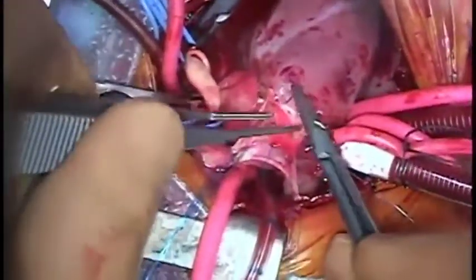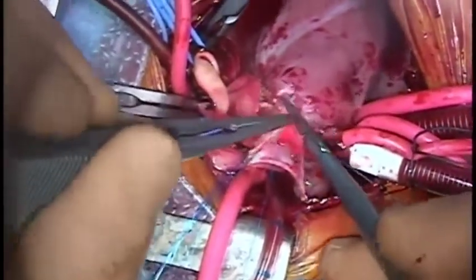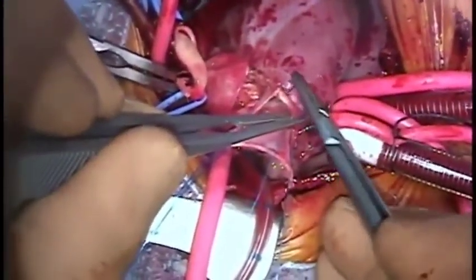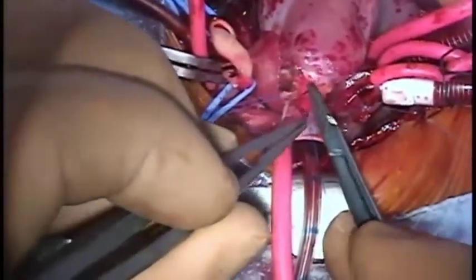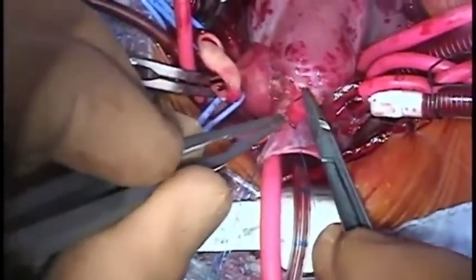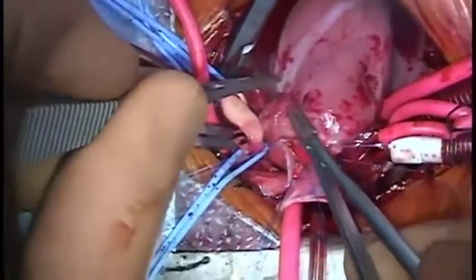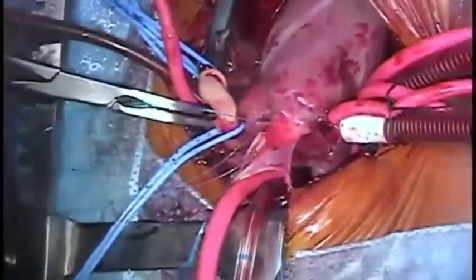Once the corner nearest the surgeon is reached, the suture is secured with a rubber shod and attention is returned to the farthest corner. In this case, because we intend to leave an atrial fenestration, the entire suture line is completed, as the cross clamp must stay on until the pulmonary artery is fully anastomosed. The suture is tied when the anterior commissure is reached. This makes later potential pulmonary artery suture line takedown easier, as the neopulmonary artery reconstruction will be unaffected.